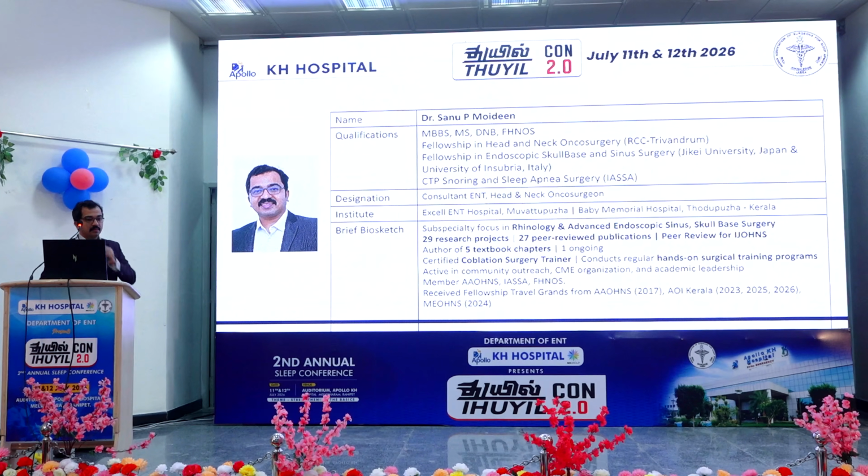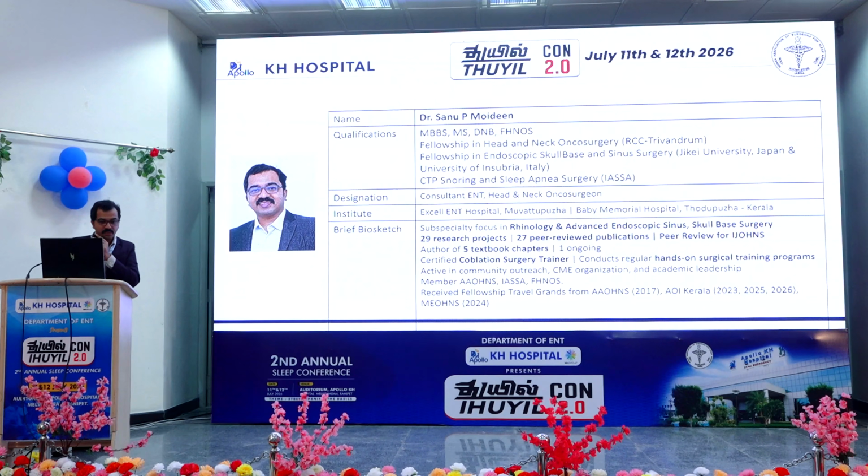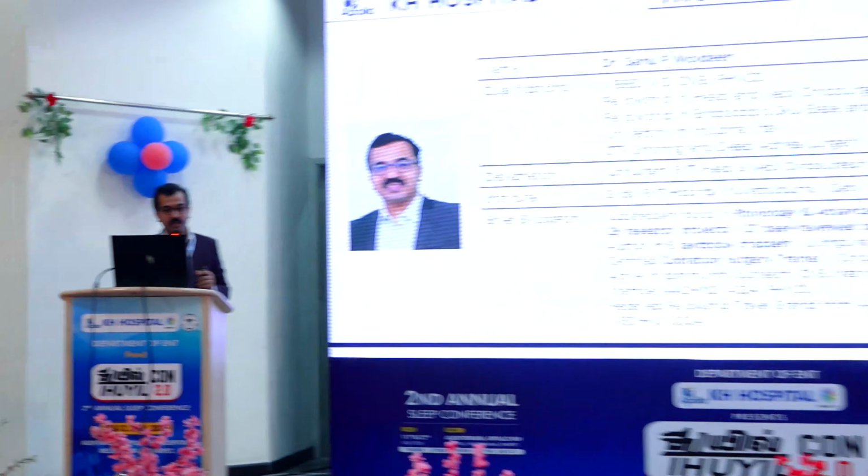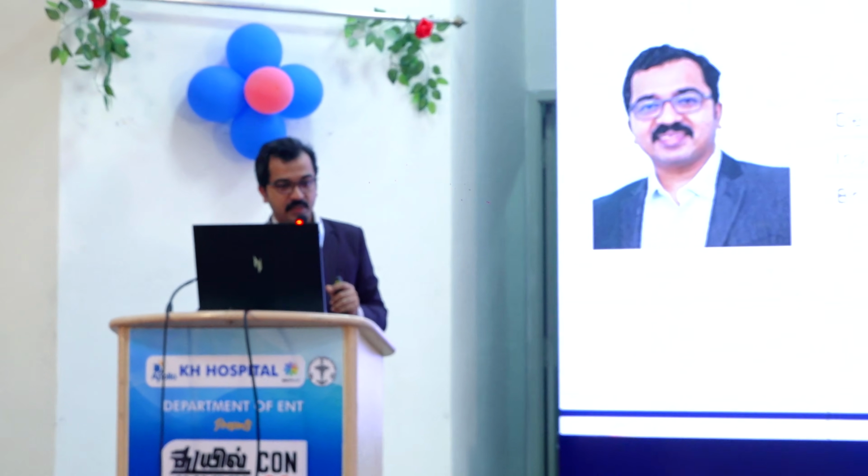At what BIS level do you keep the patient asleep? When you monitor with this BIS monitor, what is the score at which you keep? 50 to 70, sir. 50.